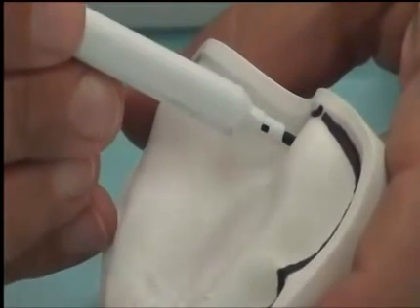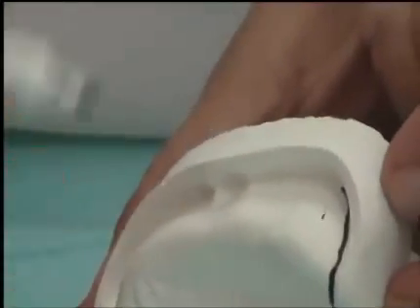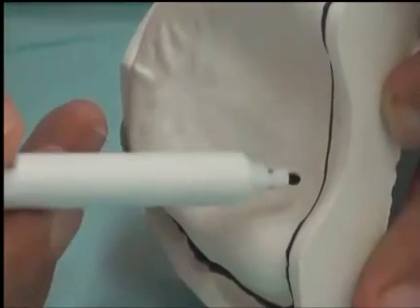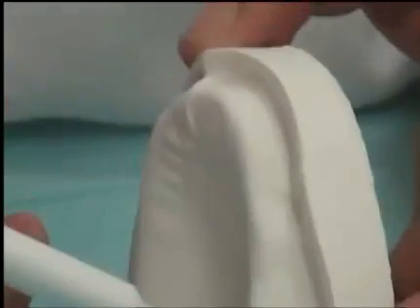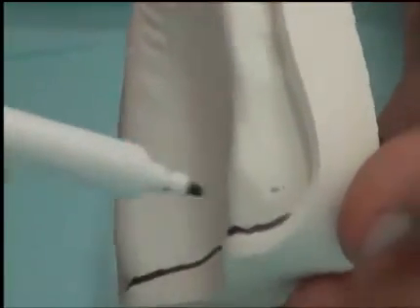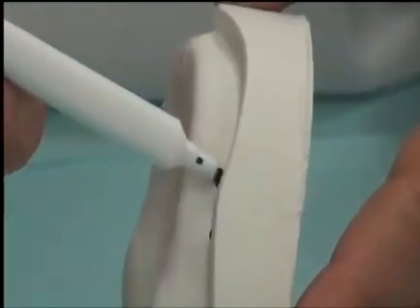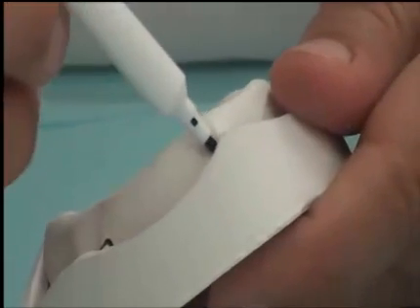From the hamular notch to the hamular notch, for tray purposes, we make it straight, and then we will change it later on. But the tray should be extending from hamular notch to hamular notch to record this area, which we will be using for post dam later on. We will be talking about that later. So from hamular notch to hamular notch in a straight manner, vertically in the sulci, up and down on the freni area, and going to the labial frenum.